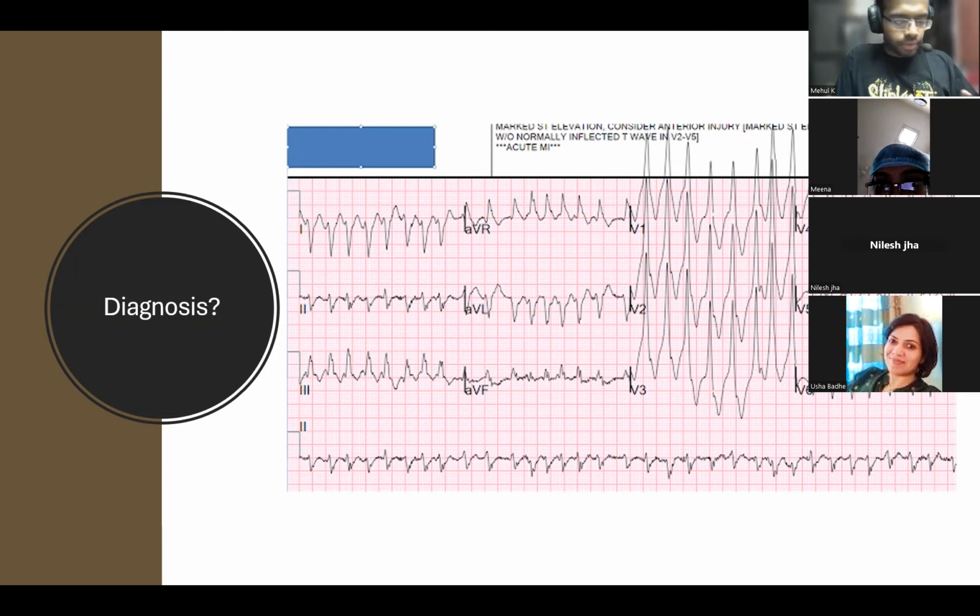It's okay, even if you're wrong, we are all here to learn. This has an RBBB morphology. Yes.